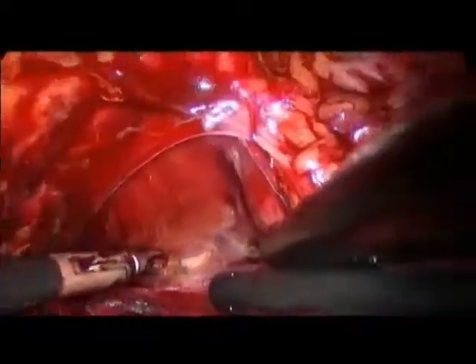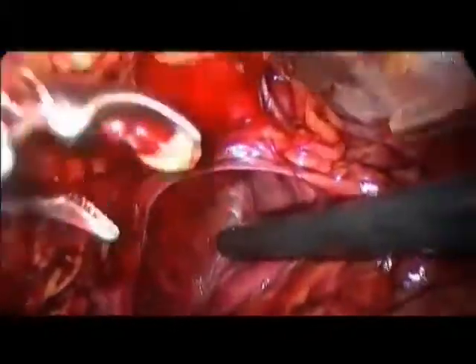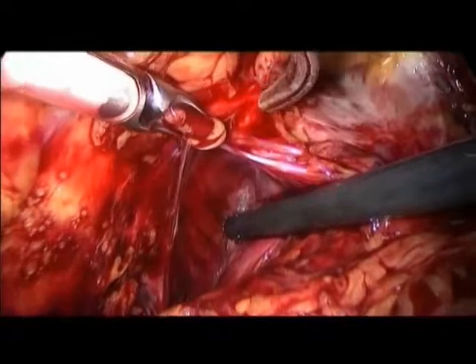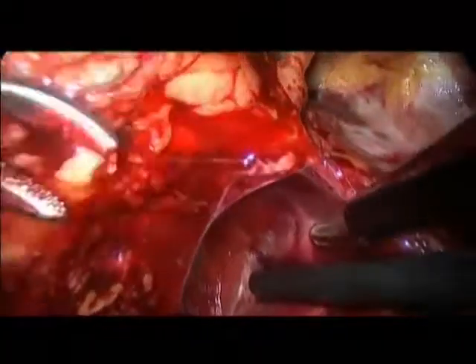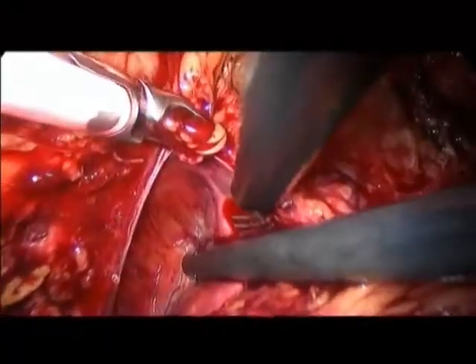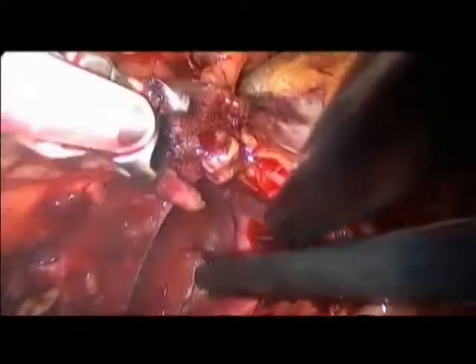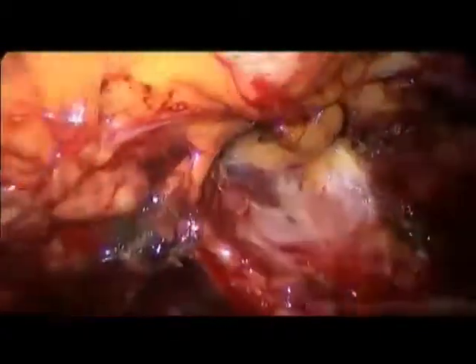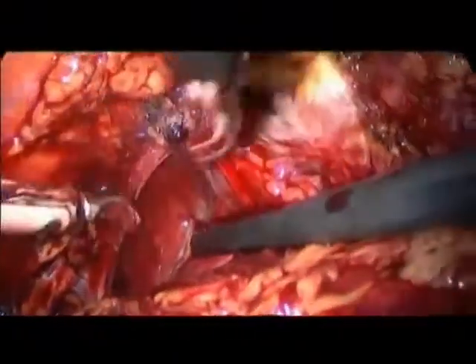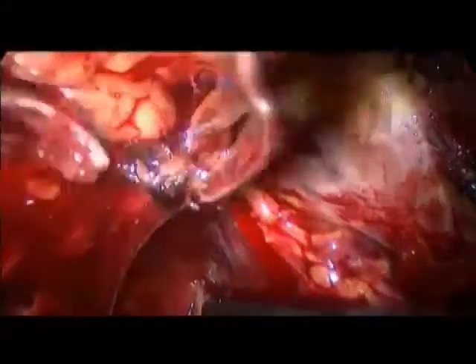And you see that progressing caudally, I will come in an area where it is generally thicker and where I will need to combine incision with the blunt pushing. And at this level, there may be sometimes perforating branches, for strange reasons, unexplained, sometimes more present on the left side. And we are actually reaching the level of the puboprostatic ligament on the left, which is a place where we will temporarily stop our dissection.